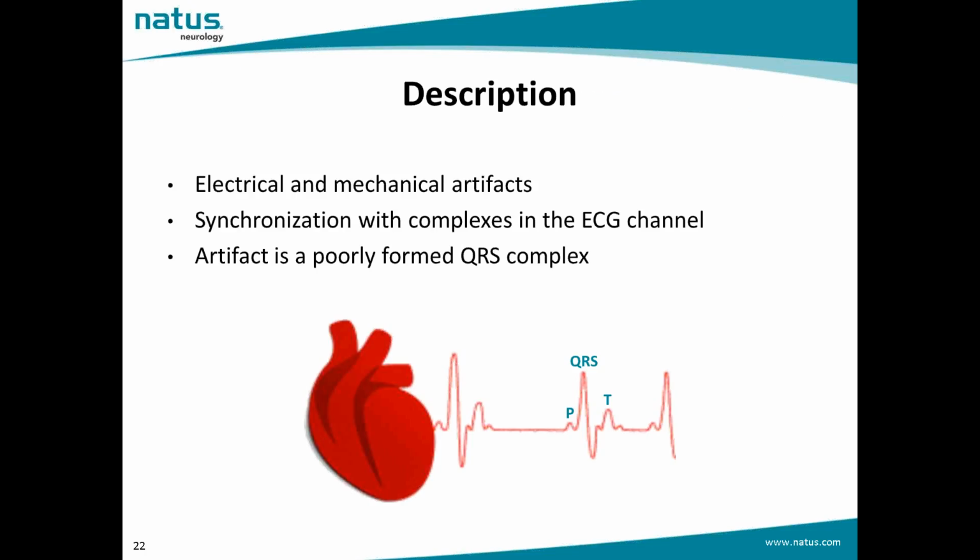The electrical artifact actually is the ECG as recorded from head electrodes, but it may not appear as obvious ECG because of the distance from the heart and the suboptimal axis for visualizing ECG complex details.